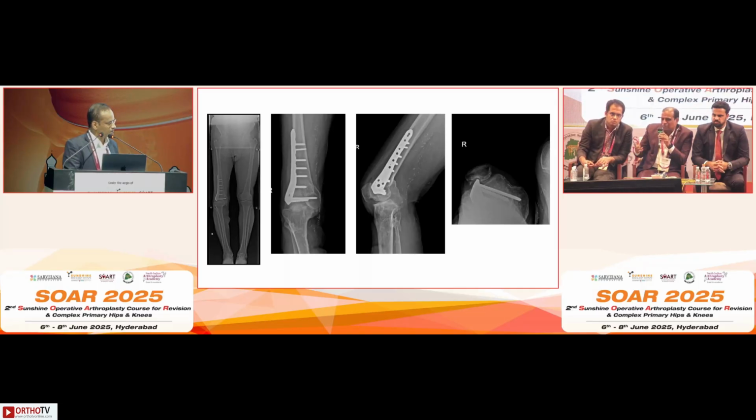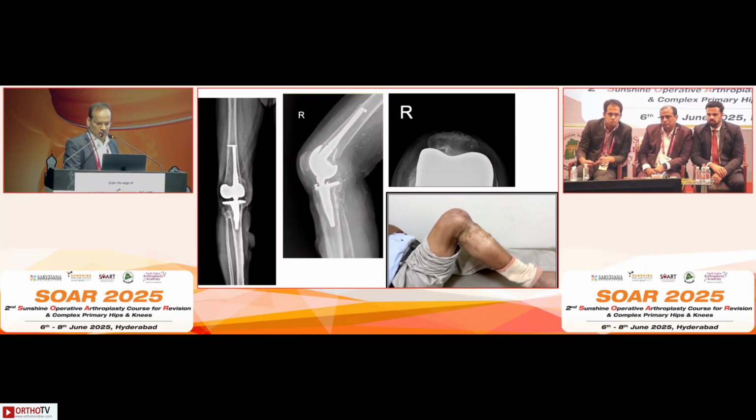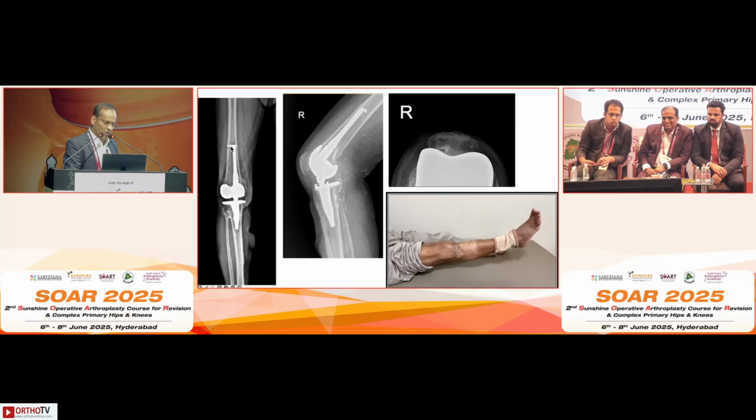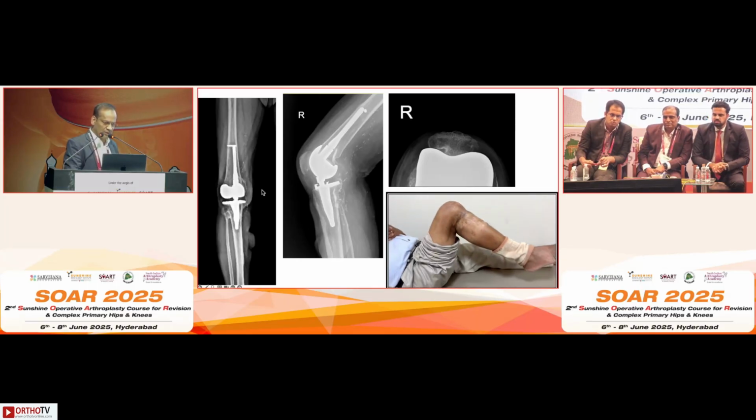If you're not able to manage, obviously you have to remove the plate and stem it, bypass the cortices and all those things. So intraoperatively, once we got the range, we could see that the lateral structures were incompetent. So we proceeded with a Zimmer hinge knee. We just removed the plate; only one screw was broken and it stayed there, but luckily my stems got past it.